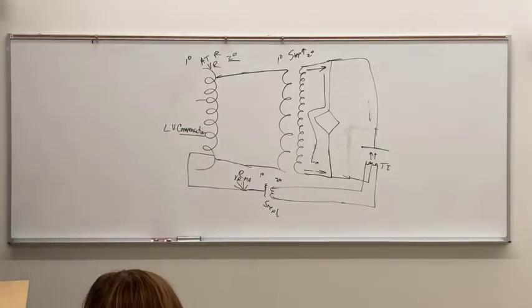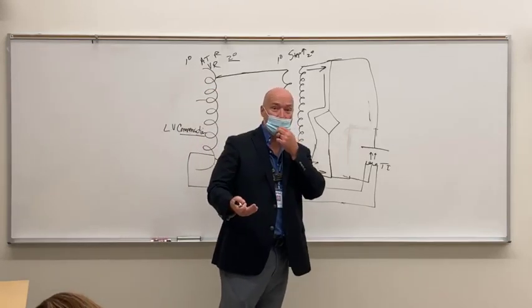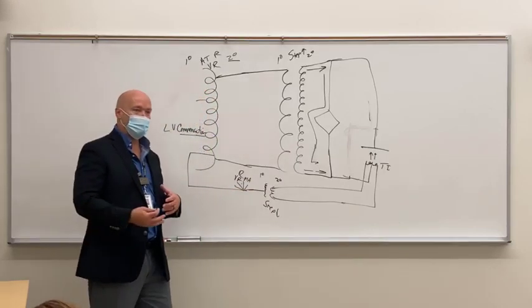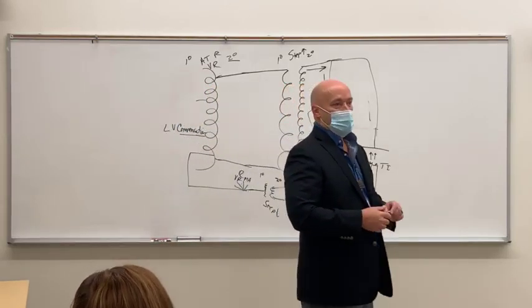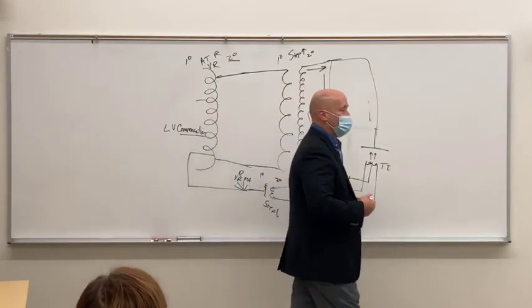All right, so we talked about all that, and then we talked about the different types of timers. We talked about synchronous timers. And synchronous timers, where did we see synchronous timers? So you're probably never going to see equipment that utilizes synchronous timers, but there's a telltale indicator that you're working with machines that use synchronous timers. What was that indicator? Been a long time since Wednesday, right?